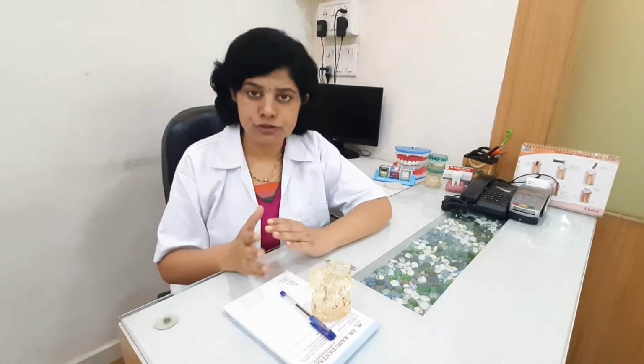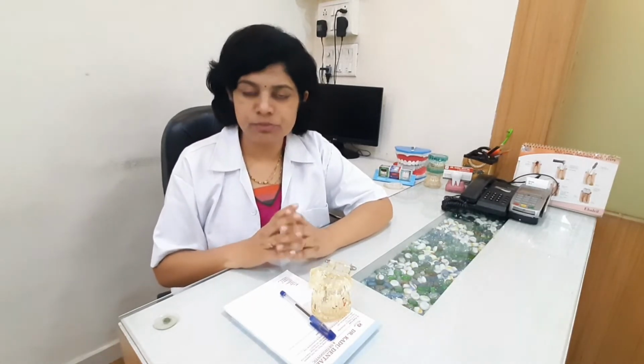Generally the waiting period in case of the lower jaw is around 2 to 3 months. In case of the upper jaw, we require a longer period, so in some cases it might be 3 to 5 months also. The waiting period for the healing of the implants also depends on the health of the patient. In some diabetic patients, it may require a little more time.